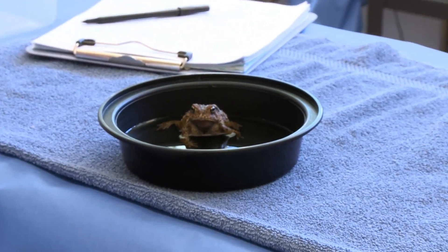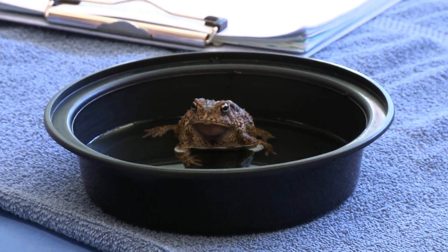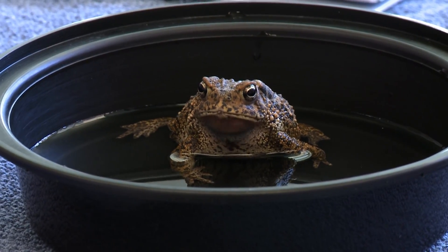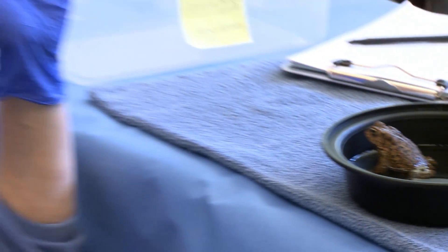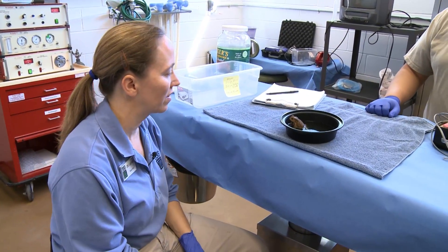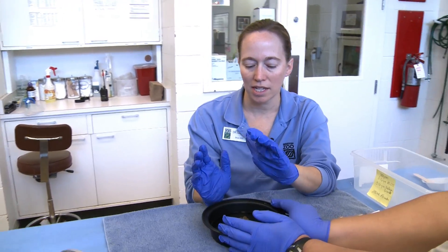Right now he's a very alert toad — he's up, looking around, eyes are open. You can see he's doing what we call gular breathing, moving his throat sack up and down. As he gets sleepier, we'll expect that breathing to slow down and him to be less up, more down, less alert. We just have to be patient.